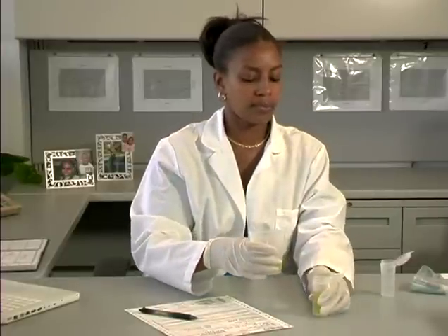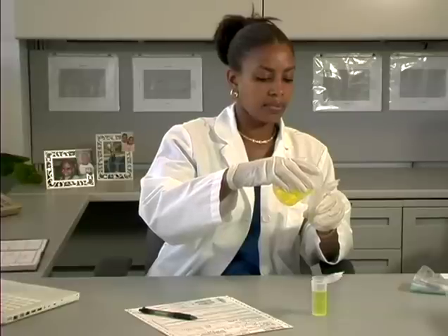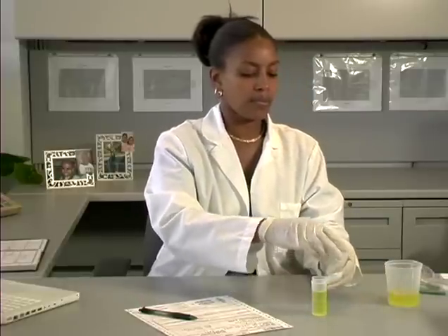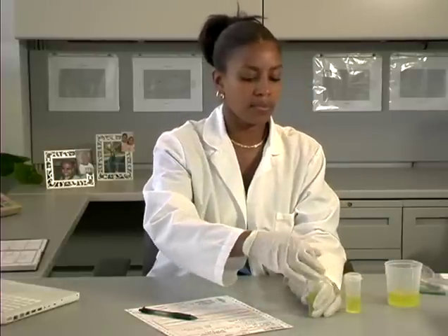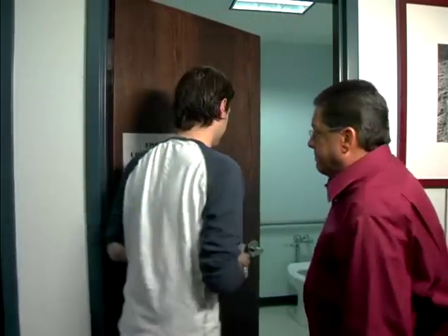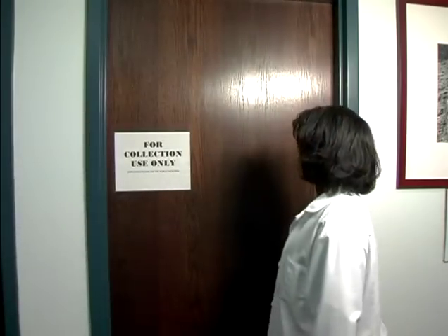While filling out the custody and control form for the first specimen, check the No box in Step 2 to indicate that the temperature was out of range. In the Notes section, reference the specimen ID number of the second collection's CCF. Next, begin the second collection under direct observation. On the custody and control form, be sure to reference the specimen ID number of the first specimen. Process the second specimen and properly distribute the custody and control forms for both collections.